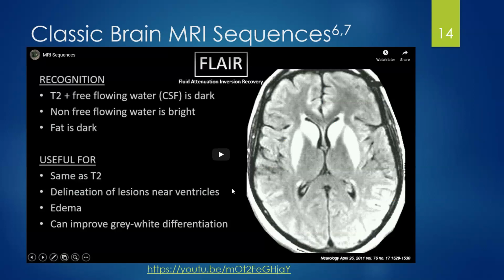All right, I want to get in now to the classic MRI sequences that we'll see with the brain series. This is done by a medical student who did this a few years ago, and gave a quick, brass tacks way of really recognizing and appreciating these sequences and making it really boilerplate. And I think it'll be very useful for us.